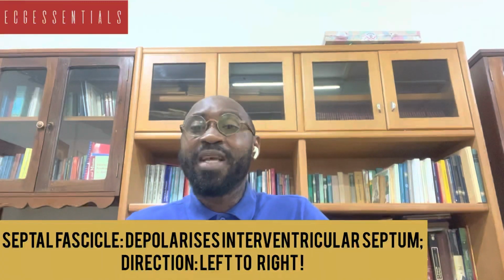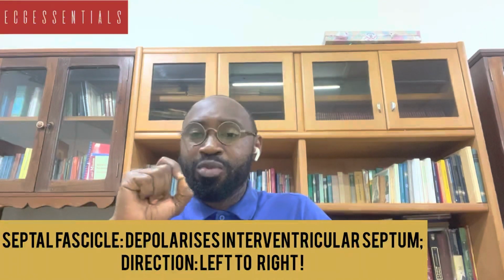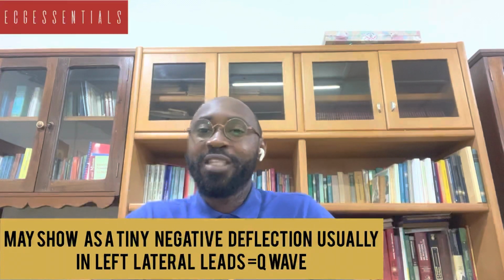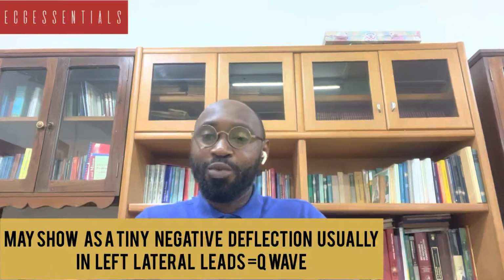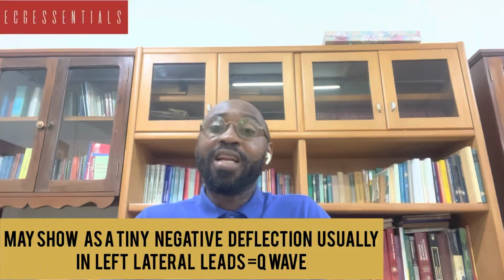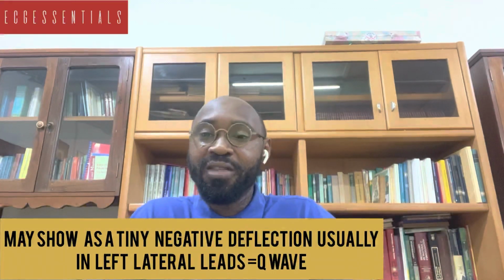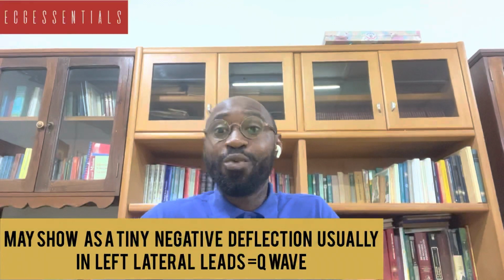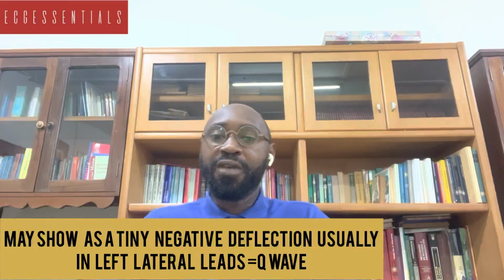So we usually expect that this electrical activity will show us a tiny negative deflection that we call the Q wave. That is the Q part of the QRS complex, and we expect that this Q wave will be more commonly seen in the left lateral leads because the information is moving away from the left to the right. So we are likely to see Q waves in lead 1, AVL, V5, and V6.